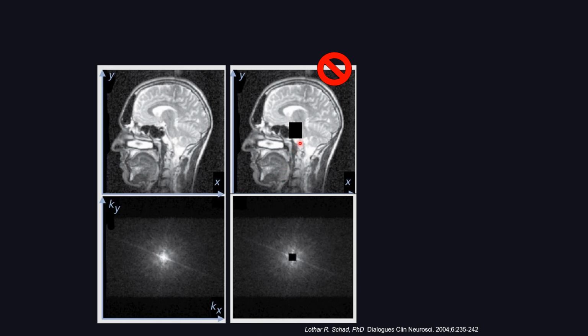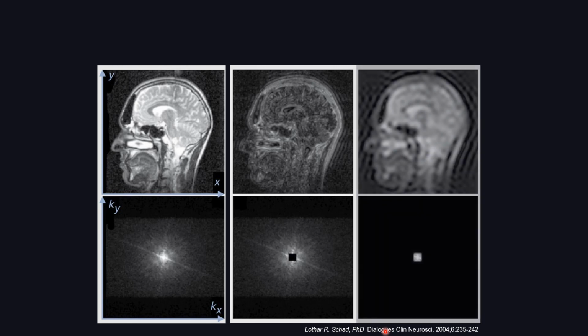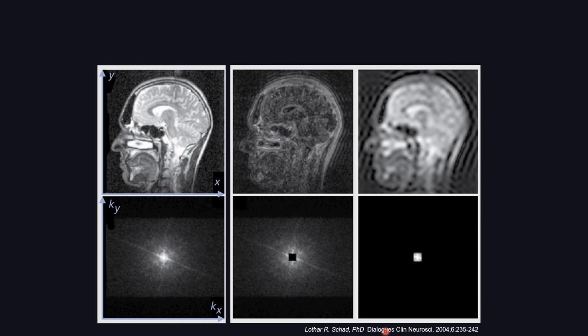Because as you know, K-space does not have a one-to-one correlation with what the final anatomical image will look like. It will not present as a loss of signal in the center of the final image. Instead, it will look something like that. You can see that the edge definition between different tissues, for example the edge of the scalp, calvarium, corpus callosum, and gray-white differentiation, remains sharp. What's lost is overall signal intensity and the contrast information between tissues.